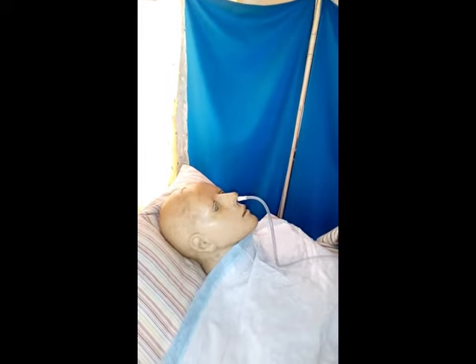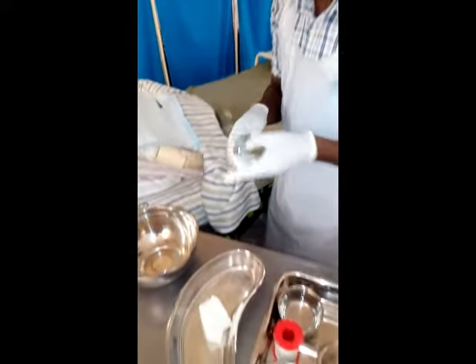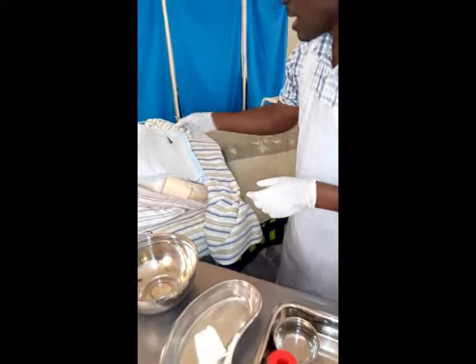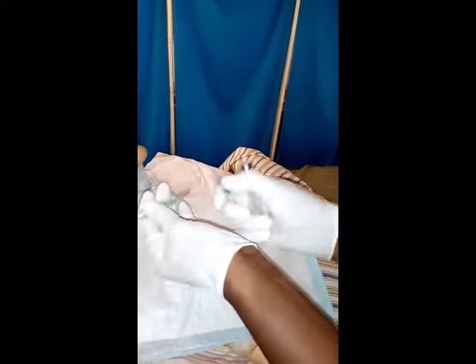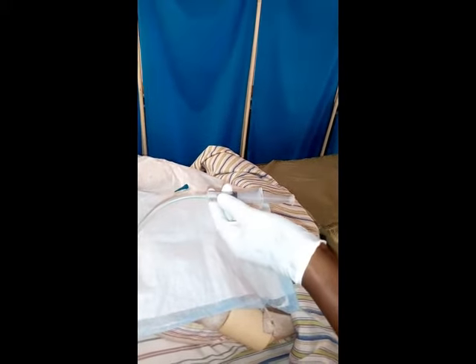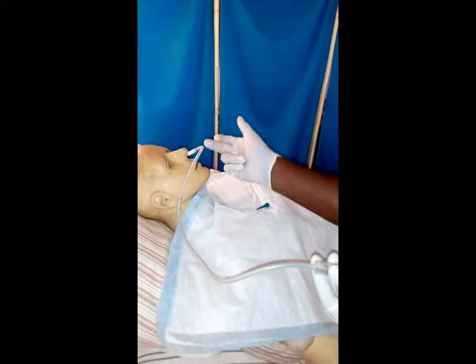You end there. At this moment now, I need to test. Is this tube inserted? Is it in the stomach? So I need to get this 10cc syringe. This 10cc syringe is going to be used there. Then I have to remove the spigot, but I have to occlude here. I have to kink it or occlude it, then remove the spigot. I can put it there, get this, then let go like that, then aspirate. At this moment, if the tube is in situ, I have to see at least gastric content coming along this tube.